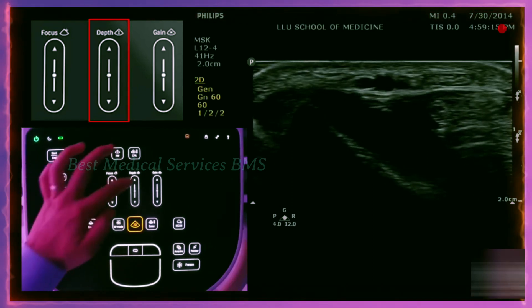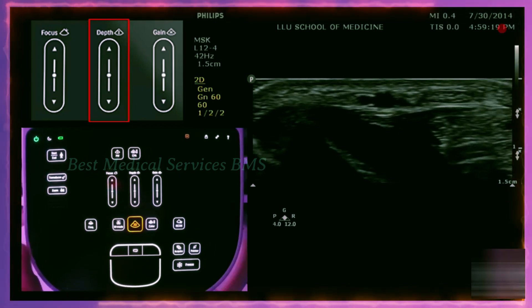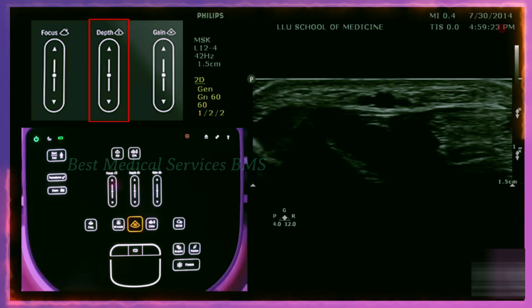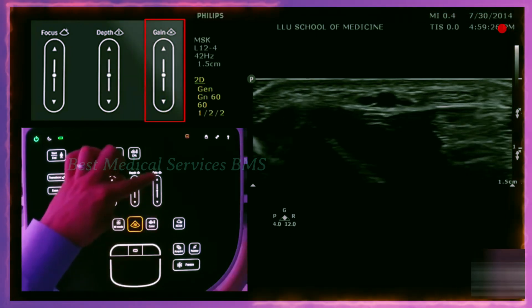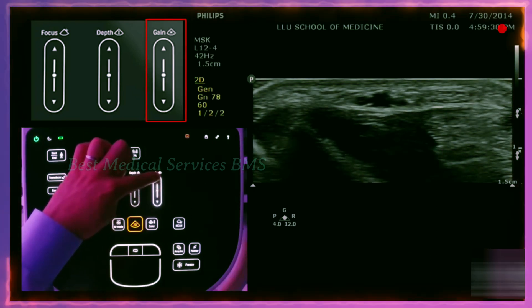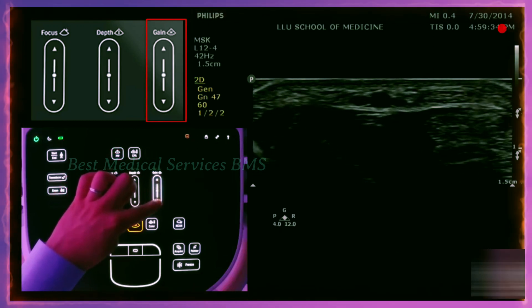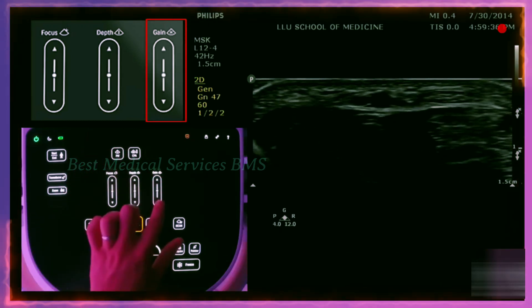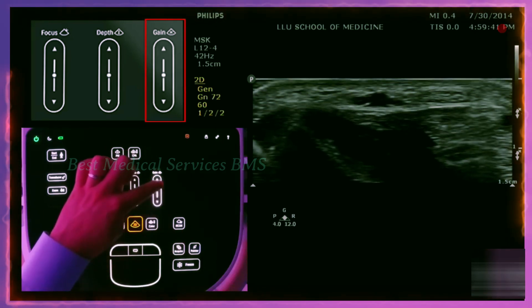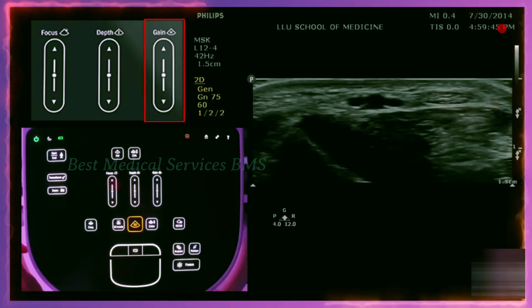Here is the appropriate depth for the radial artery — right in the middle. The other important control besides depth is the gain. These buttons on the right side control the gain. If I go up, the gain increases and makes the screen brighter; if I go down, it makes it less bright. The gain basically just makes it brighter — you can tap it or go up and down. Every machine will have a gain and depth button, so you just have to find where those are.